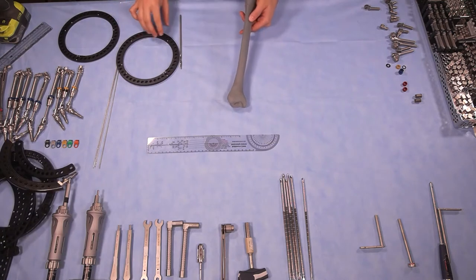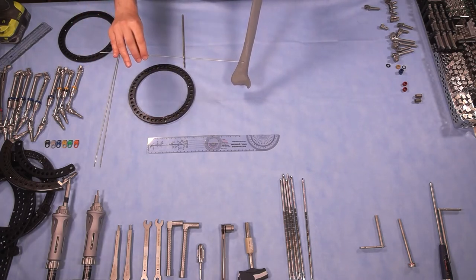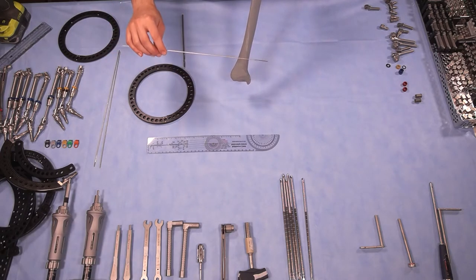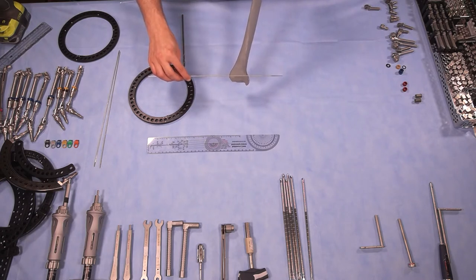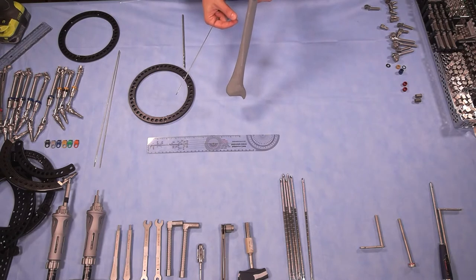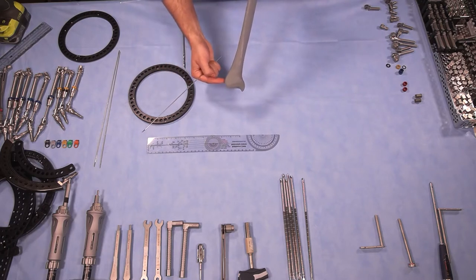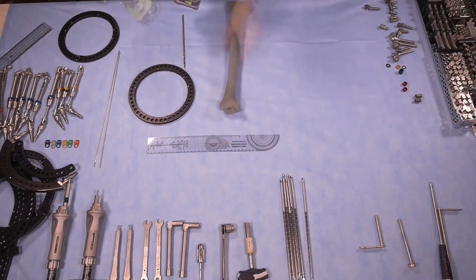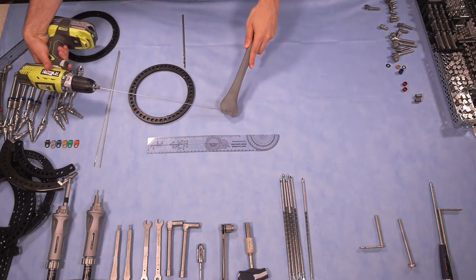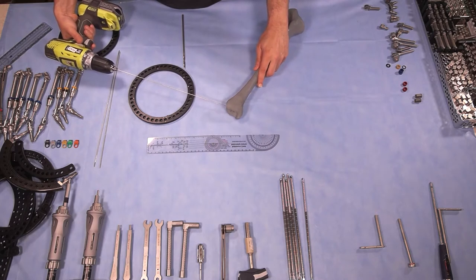The best way to start applying an external fixator in a metaphyseal region is by suspending it with a wire orthogonal or perpendicular to the desired mechanical axis. In this case, we want to reach an LDTA — a lateral distal tibial angle — of about 90 degrees, and the easiest way to do this is to insert the wire parallel to the joint line. Because we have a fibula and will need to distract the bone to correct the deformity, we need to transect the distal tibiofibular joint to avoid subluxation during lengthening.